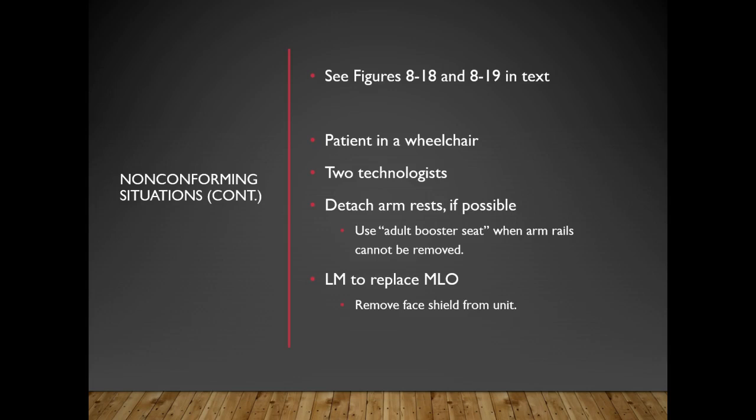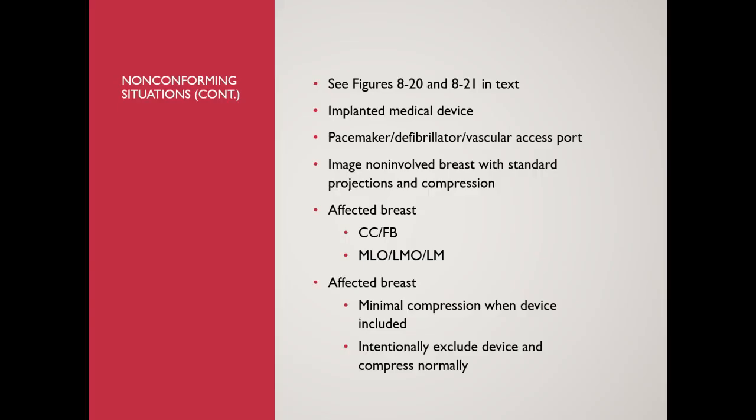It depends on the patient. Some patients may be confined to a chair but are very mobile from the waist up and can get into the positions that you need. You may not need to make those changes, but just remember there's always that lateral medial approach versus the medial lateral approach in these challenging situations.